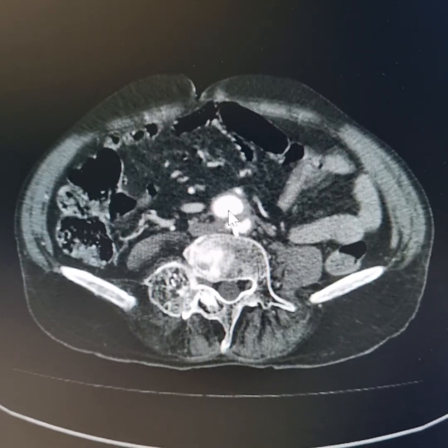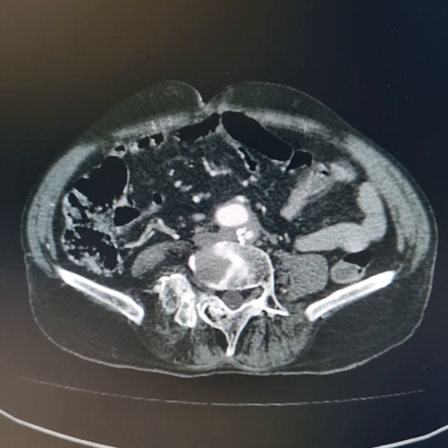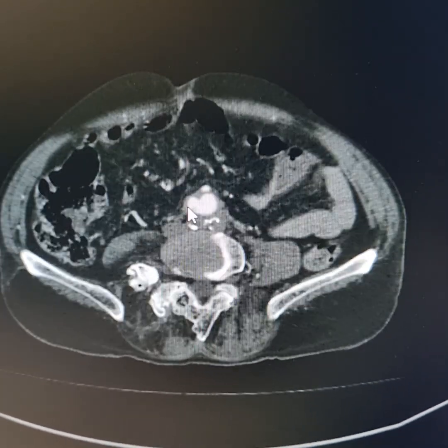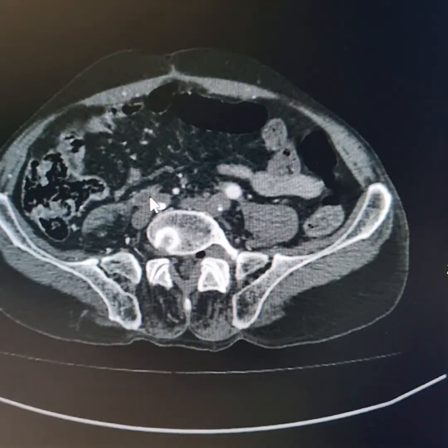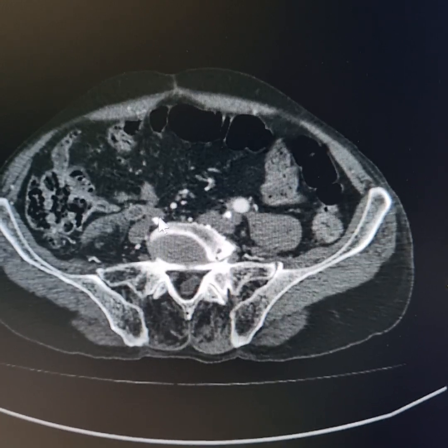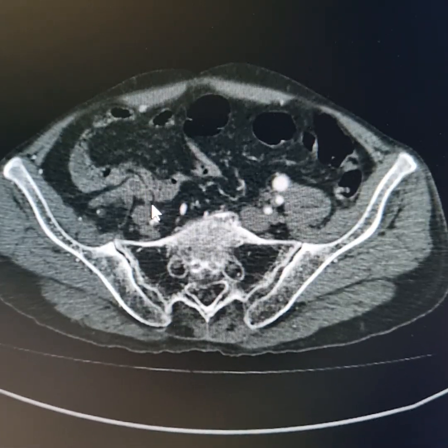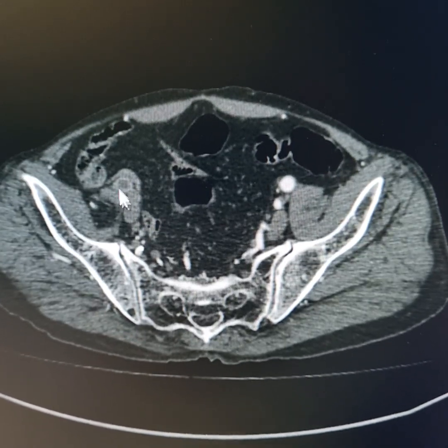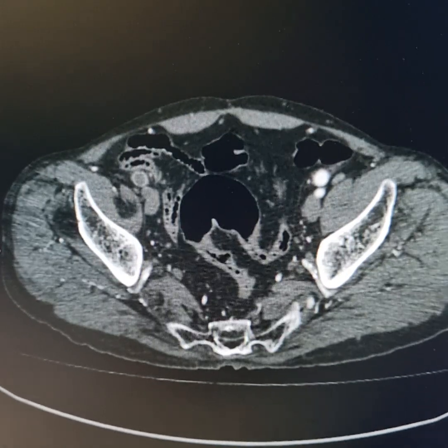Now, this is the site of the surgery and the anastomosis of the bypass graft. First, let us evaluate the right side. This is the graft, which is completely thrombosed. This is the right common femoral artery. This one is the external iliac artery. Now, this is the graft, which is completely thrombosed.